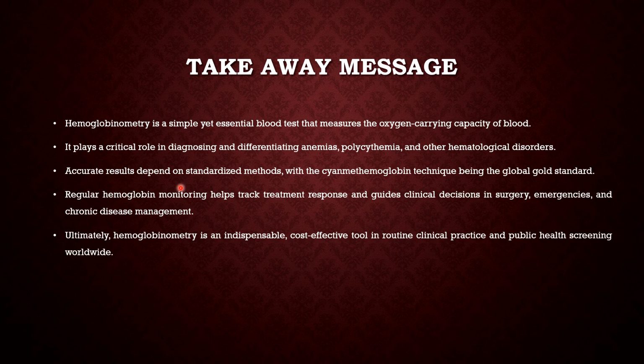Next, accurate results depend on standardization, with the cyanmethemoglobin technique being the global standard. Next, regular hemoglobin monitoring is very important to track the treatment response. Then ultimately, hemoglobinometry is an indispensable cost-effective tool in routine clinical practice and public health screening worldwide. So these five are the takeaway messages for hemoglobinometry.